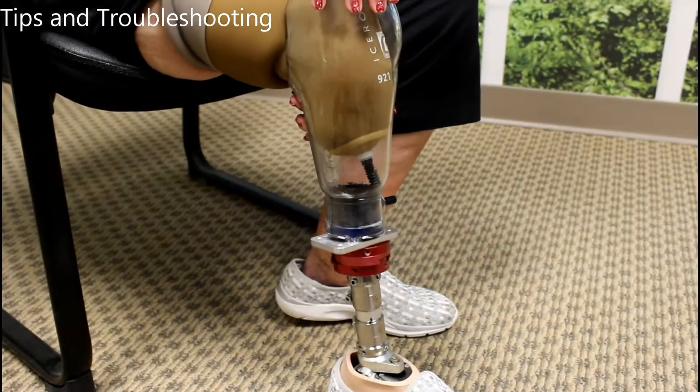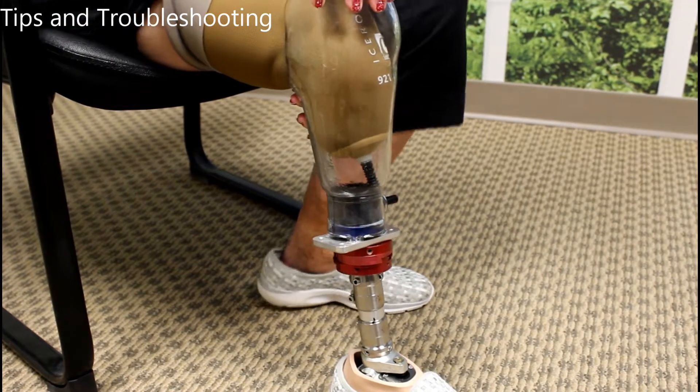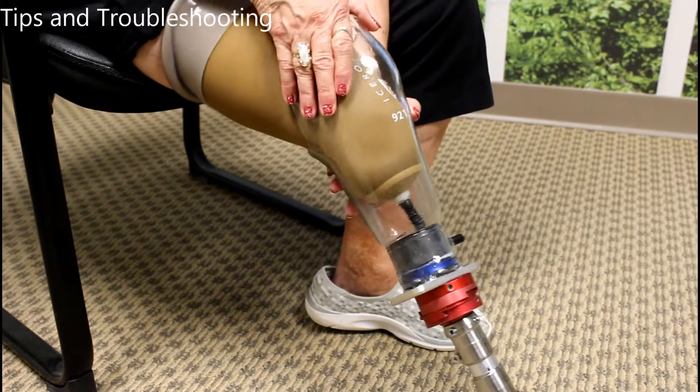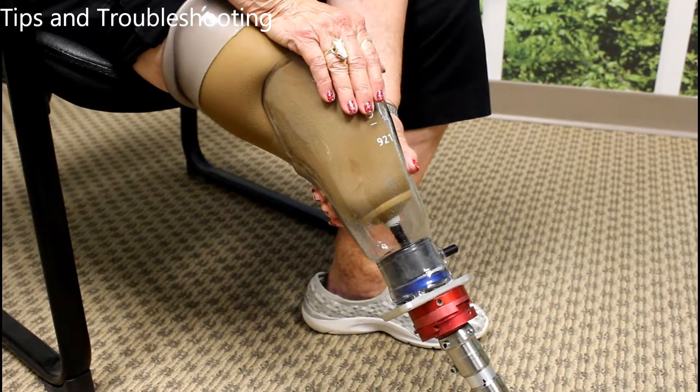When donning your prosthetic, most patients need to keep their knee at approximately 45 degrees. This clip shows what happens to the pin when you keep your knee at 90 degrees while trying to don the prosthetic. Even with the pin properly aligned, the 90-degree position of the knee causes the pin to become stuck on the lock mechanism. As soon as Patty moves her knee to 45 degrees, the pin easily aligns with the lock. This is why some patients choose to stand when donning the prosthetic without getting any clicks first. If you choose to do this, be aware the socket is not connected until clicks occur.